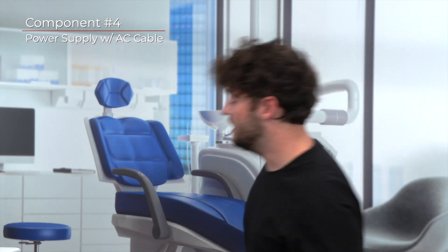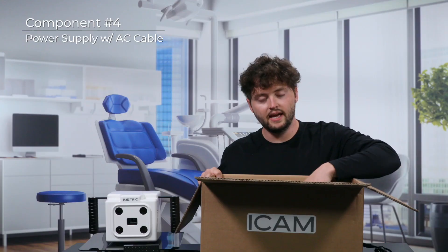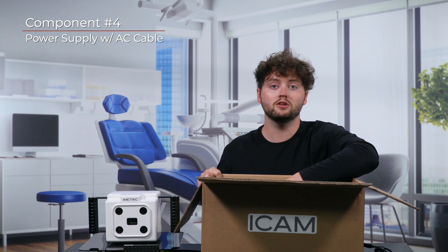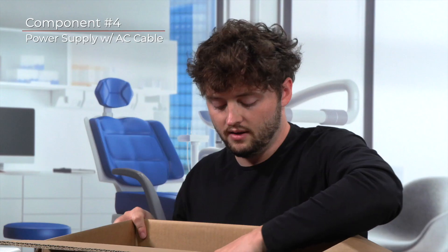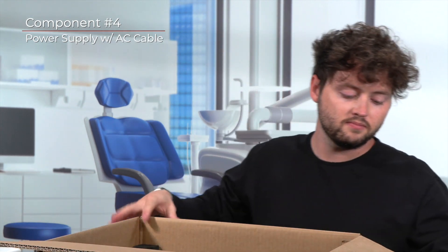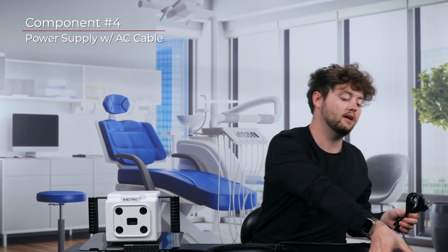Now let's identify the AC power cable. The AC power cable is a singular cord that sends 110-volt power to the power supply. You will find it at the bottom of the box. The cable is long and black and it has a male and female connector on each end. The male connector will be inserted into a three-prong wall or power outlet. The female connector will then be inserted into the power supply itself.